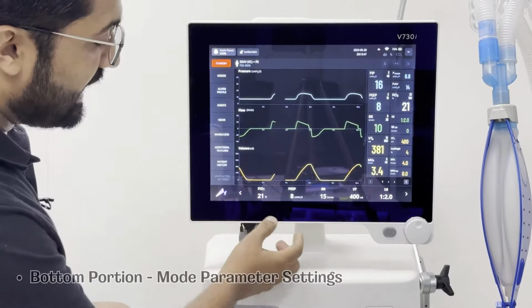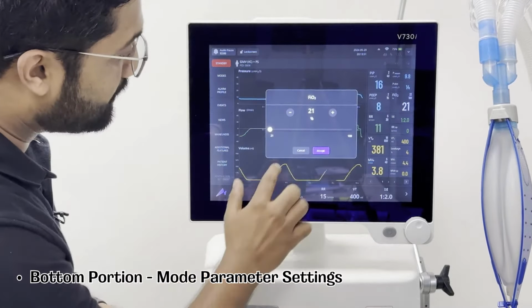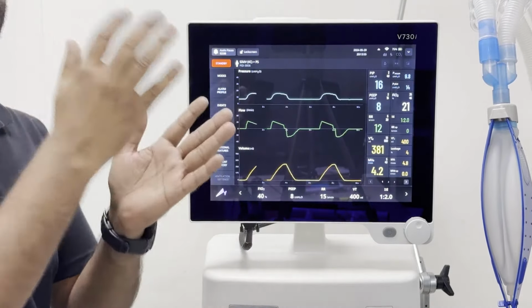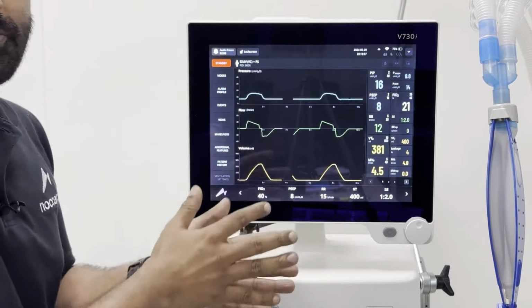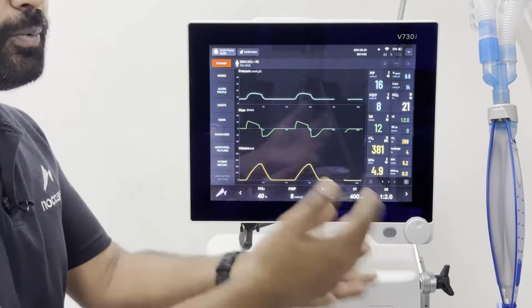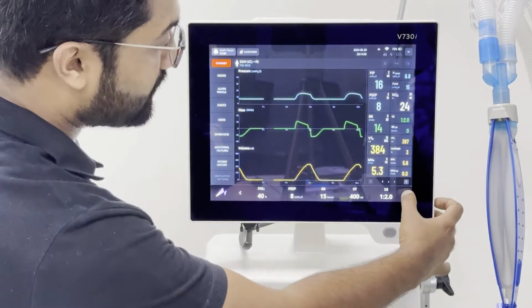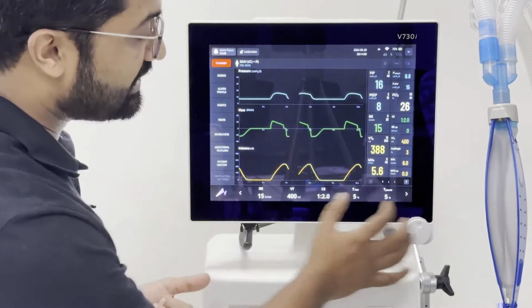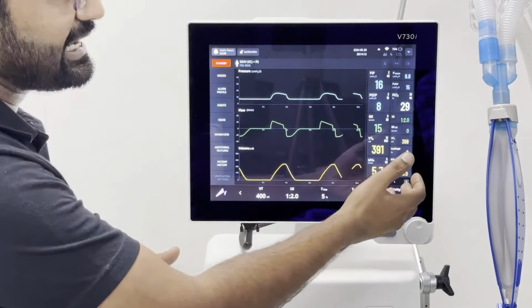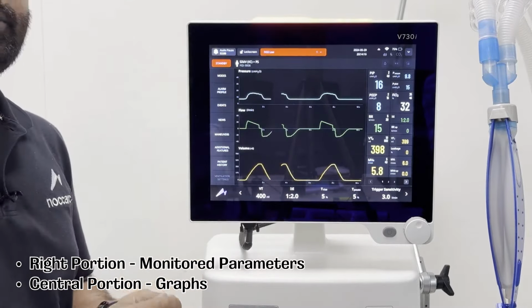The bottom bar ribbon has been dedicated for the ventilator settings, where you can select any parameters and change the value while the ventilator is running, and you do not have to go back to the main screen and to the modes page to do these setting changes. This allows you better control and observation of what is happening to the patient when you change the particular setting. For additional settings, you can press this button and see the different settings which are also available in this particular mode. And then we have a dedicated window which also allows you to monitor the parameters which are being delivered to the patient.